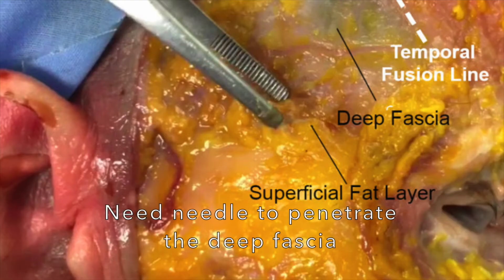With this cannula technique, this is the simplest of the 3. And being superficial, less filler is needed to show results. The second layer: subdeep fascia. The deep fascia is fairly thick, and in order to go subdeep fascia, only a needle is possible. The cannula won't be able to penetrate the deep fascia.